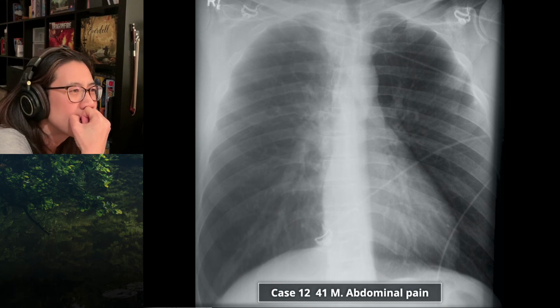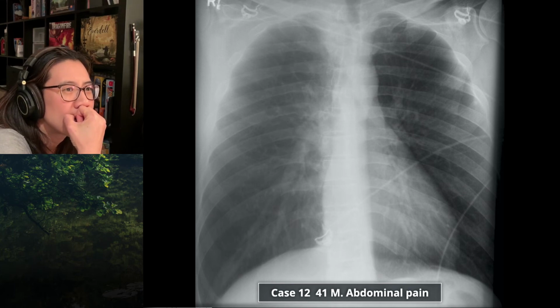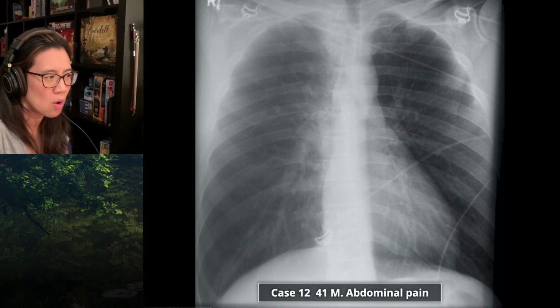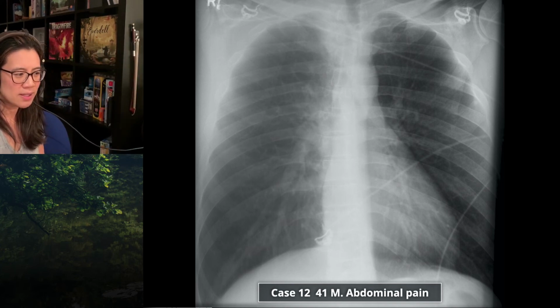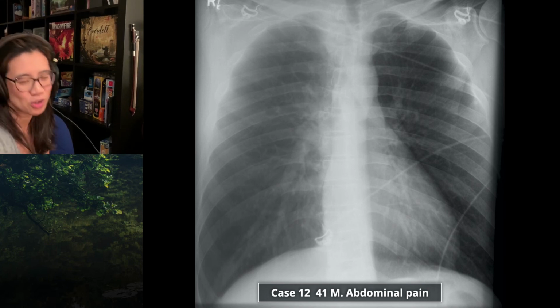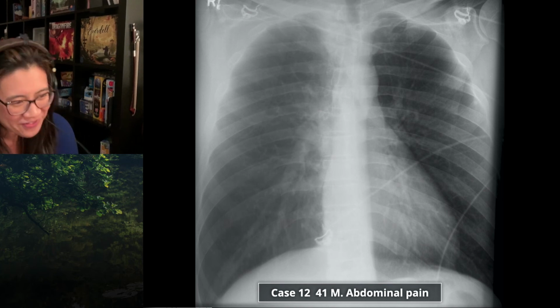What else? What do you think of the cone marks? The cone marks? You mean the way... Oh, I see what you're saying. So on the left, at the edge of the film, I can see like a stripe. Is that what you're talking about? Number one, it's not a film, it's digital. Sorry, on the edge of the image.